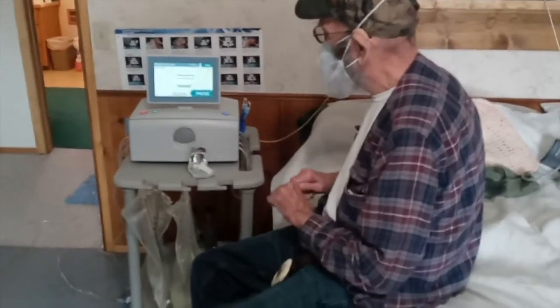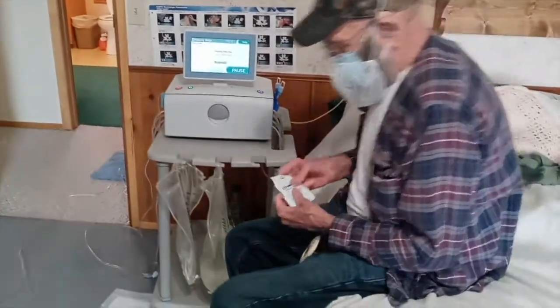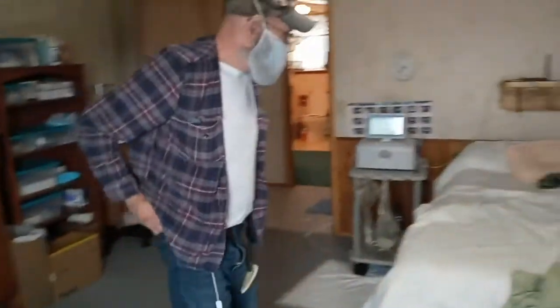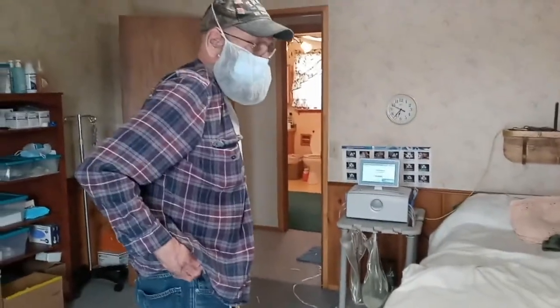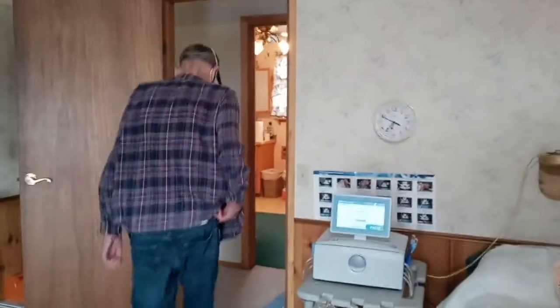The system is emptying remaining solution. We're done. Please wait. Now we've got to wait 15 minutes for that to pump all that off. So I'm going to go put my pants on, make up my bed, and come back and unhook that as soon as it pumps off. It takes 15 minutes to pump that fluid out of there. So I'm going to get ready to go downstairs.